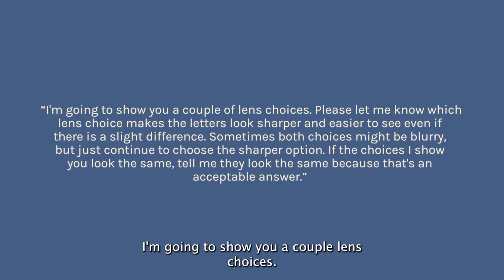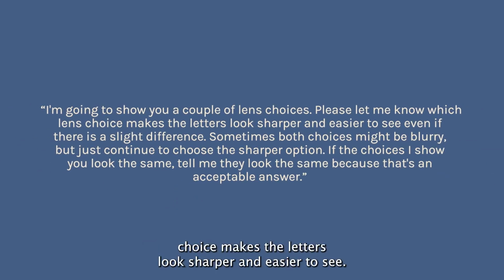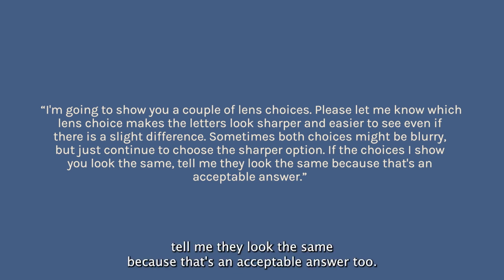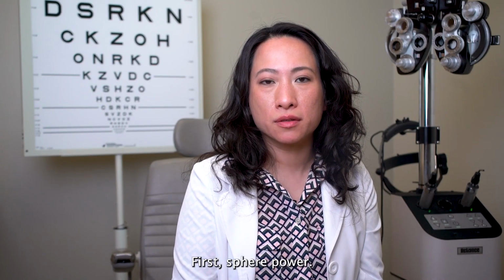I'm going to show you a couple lens choices. Please let me know which lens choice makes the letters look sharper and easier to see, even if there is a slight difference. Sometimes both choices might be blurry. Just continue to choose the sharper option. If the choices I show you look the same, tell me they look the same, because that's an acceptable answer too.